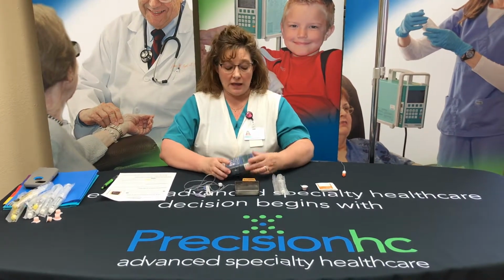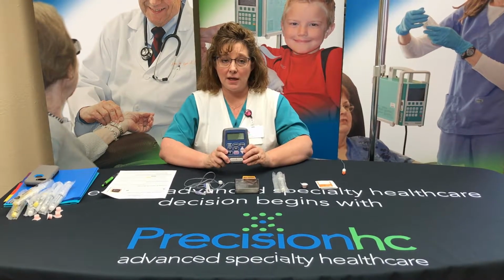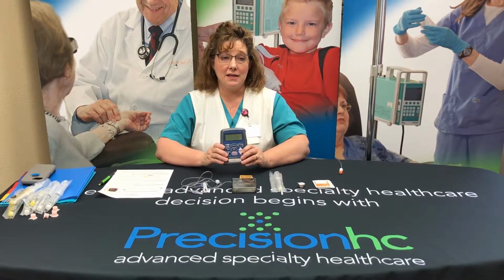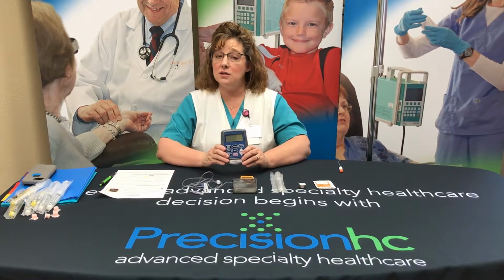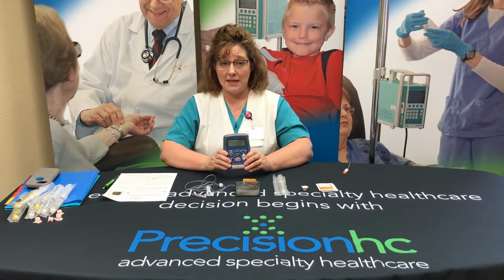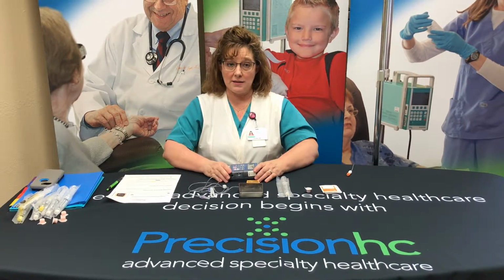You will be given a backup pump, so you can get your pain medication ready by attaching it to your backup pump and then connecting it to your IV line as soon as you disconnect the old PCA pump. So we're going to begin by getting our supplies together.